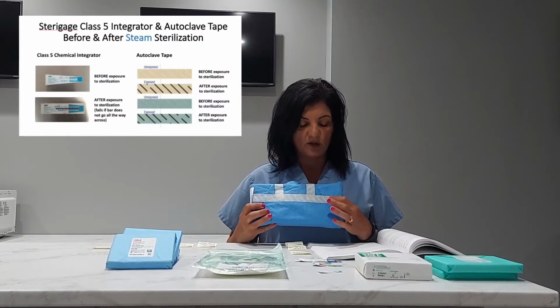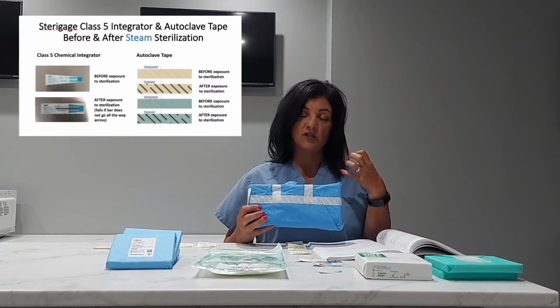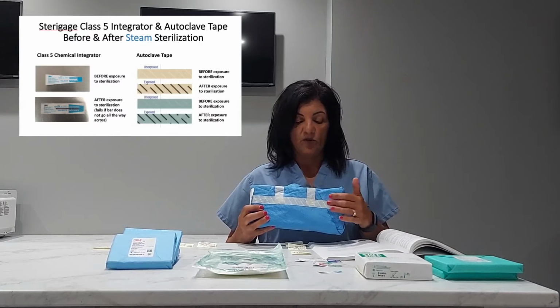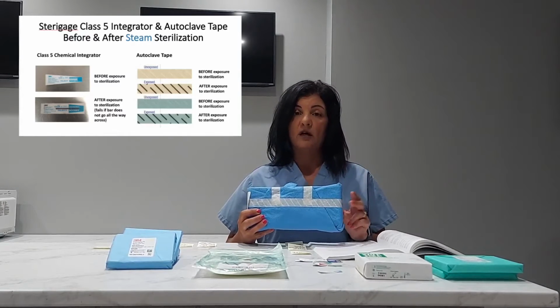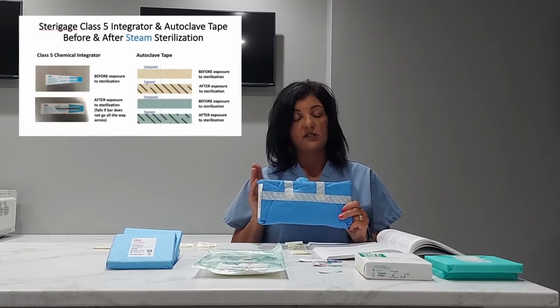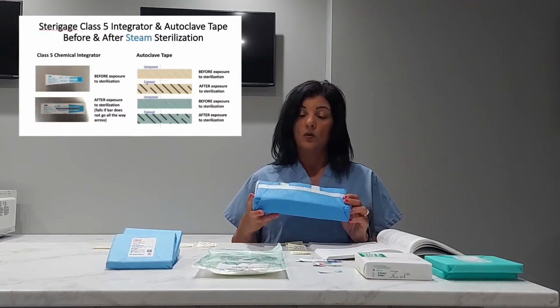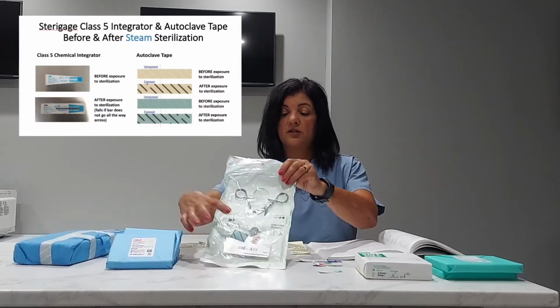This will turn from cream to black, so the stripes will turn black. That's a visual indicator to me that this type 1 indicator has reacted to one of the 3 parameters for steam sterilization. So that's my first indicator that the package was either unsterile, such as this one, or sterile, such as this one.